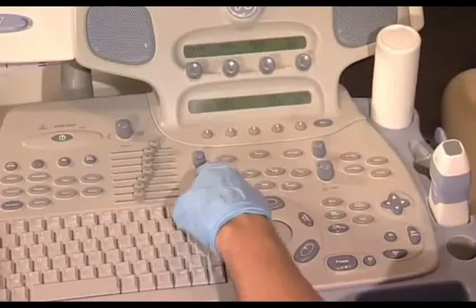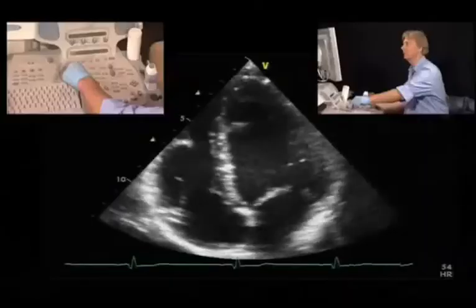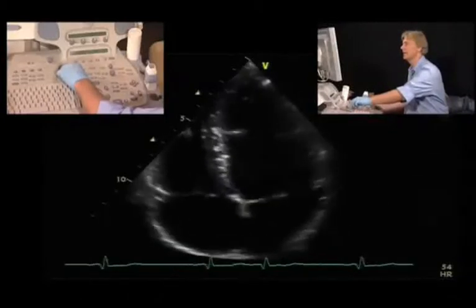Probably the most important button in echocardiography on the machines is the gain button. It's similar to the volume button on your stereo. And it's this button here. And you can see what happens. If I turn this button, I will increase or decrease the intensity of the image.